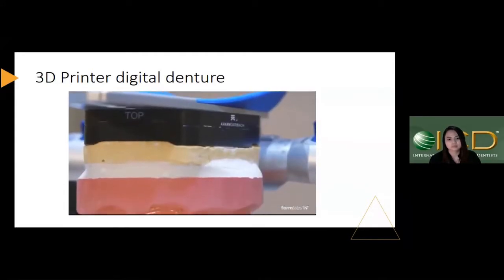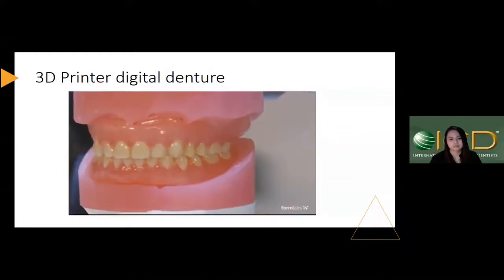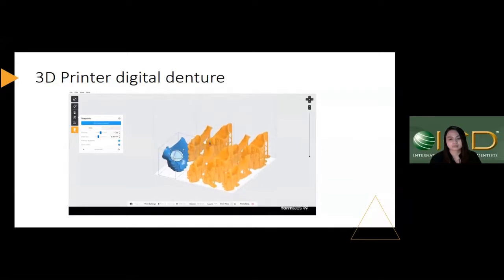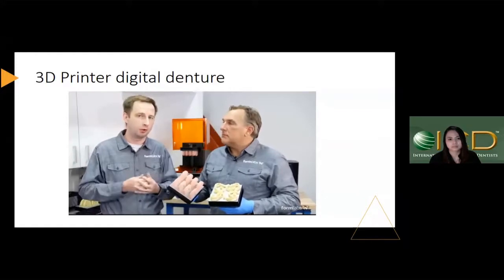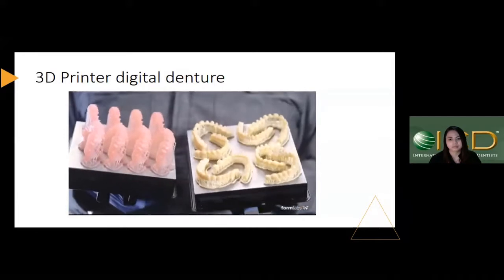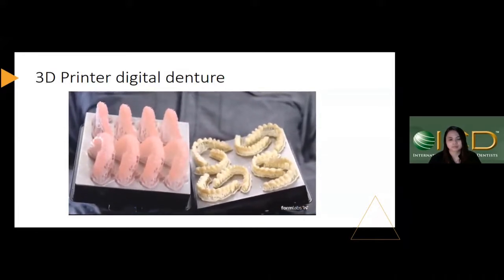If you are looking for a detailed step-by-step guide, please refer to our 3D printed denture application guide. Formlabs PreForm software will accept any open file type from dental CAD software. We've been mainly using 3Shape here at Formlabs for digital dentures so far, but with any CAD software, it's really important to consider what tooth libraries are used and what output they will produce.